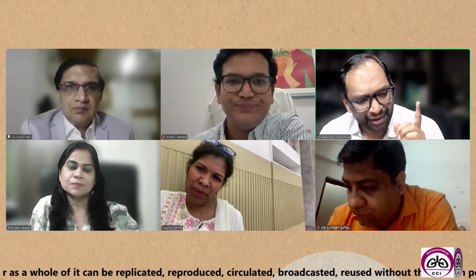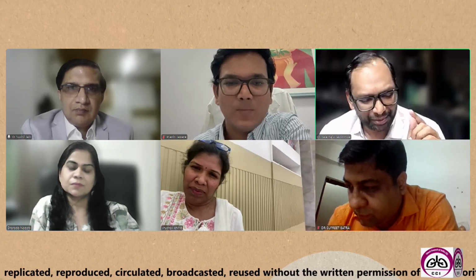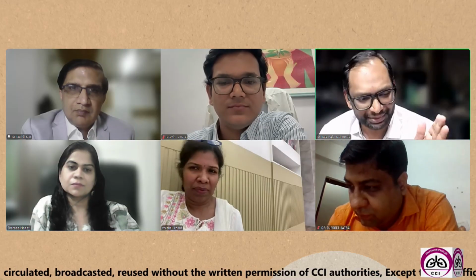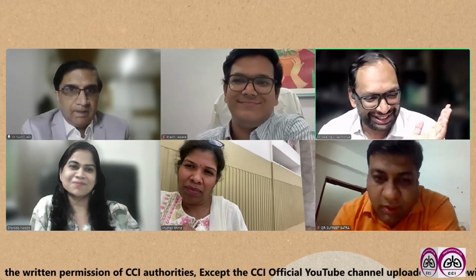The first pass is always a slide. So I usually do all slides in the first pass. If it is a good pass, then no more slides. Just directly put all the next material, whatever comes, into the saline sample and the 10% neutral buffered formalin. Only these two. And just pray to God and you get material in that.